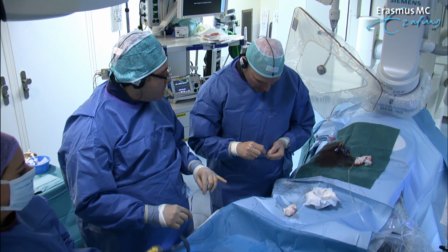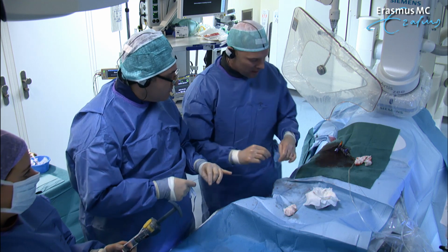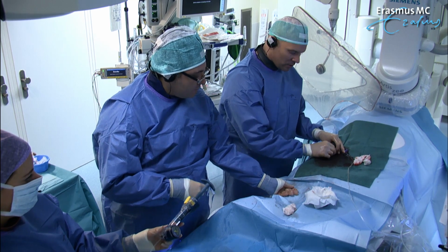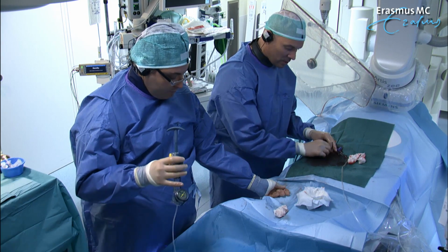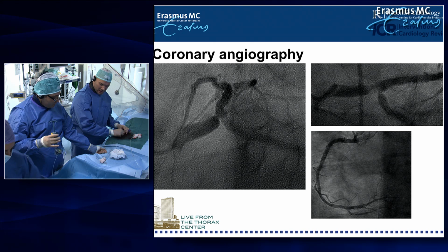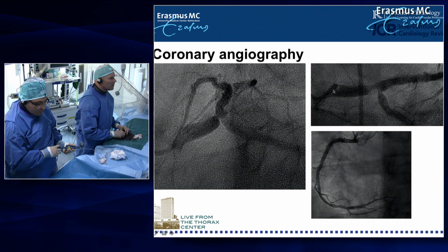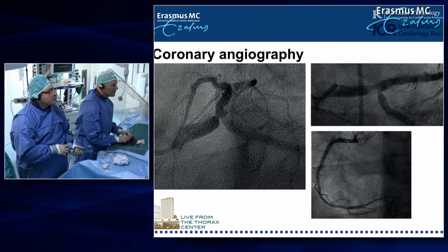Yeah, so what I like to do in these kind of situations is to have the stent ready in the side branch and have a bumper balloon in the mother branch, in the main branch. And then I will only use that balloon for positioning at first. So then I will not inflate the balloon, but I inflate the stent, I deploy the stent. And then I take out the stent balloon and then I inflate the bumper balloon. There's several ways of doing this. I like this technique in particular.